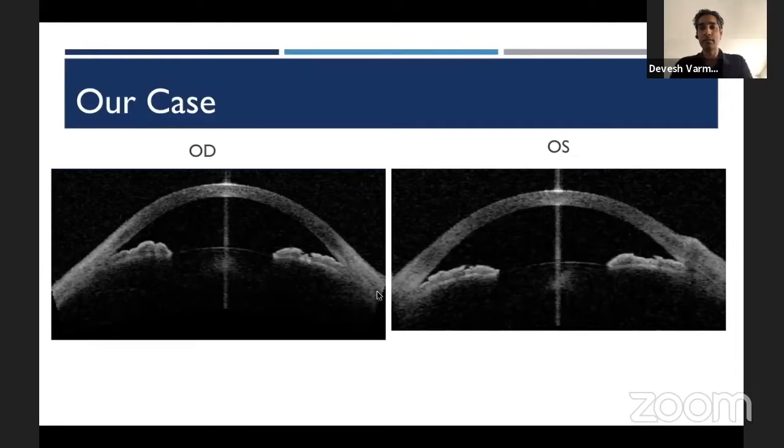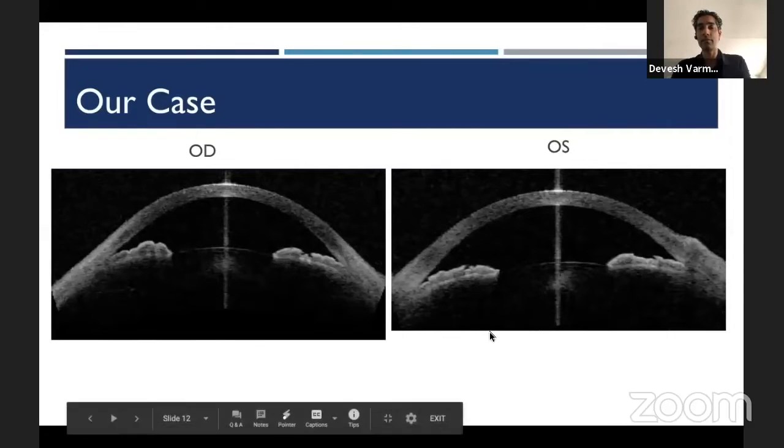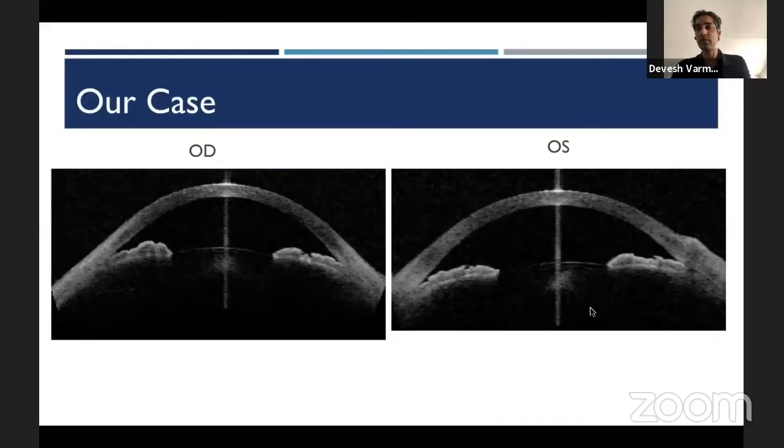I agree that lens rise doesn't look to be a huge component here. Pupil block doesn't look to be a huge component here. And although it's not easy to image ciliary processes with an anterior segment OCT, and this is a good example of where you can't really see it, I would probably say this looks like there's some significant plateau pushing that iris forward, particularly if you look at a left scan on the right side. You can kind of get a sense of this. So the left eye scan and the right side of that image. So all the way to the, yeah, exactly. You can kind of get a sense that there's ciliary processes pushing up over there. So I would say these angles are closed with plateau, a small amount of lens rise maybe, and a small amount of pupil block with primarily plateau.